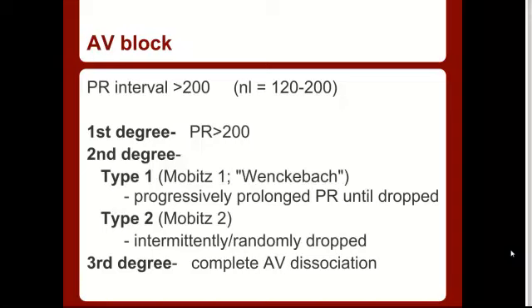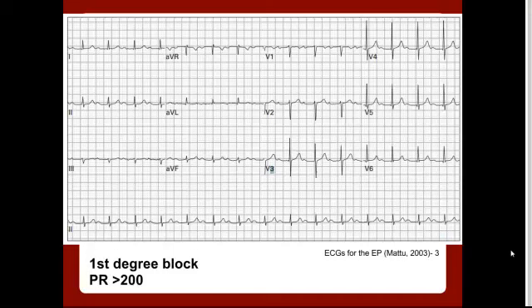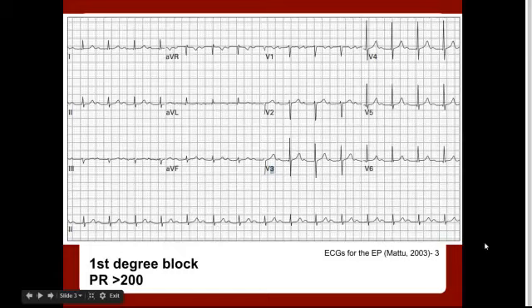I think the best way to go through each of these is to give an example of each one. I got these EKG examples from Amal Mattu's ECGs for the Emergency Physician, 2003 edition — great book, available on Amazon. This is an example of a first degree block. Looking at the rhythm strip at the bottom, you can see there's a P wave and a QRS, and it's definitely widened greater than 200. However, these are all fairly uniform as they go along, so we can call this a first degree block.